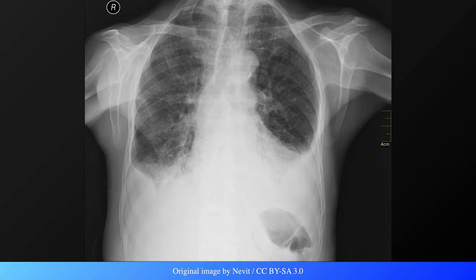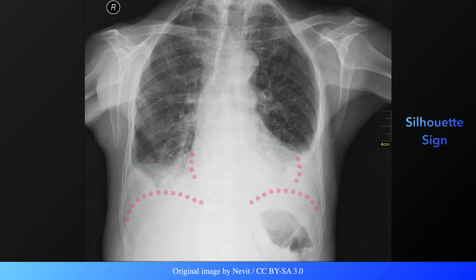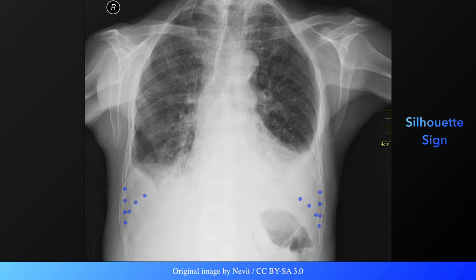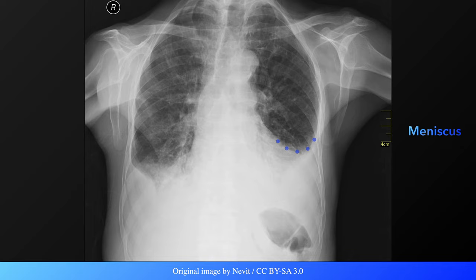This is a plain radiograph of an individual with bilateral pleural effusions. The first abnormality apparent is the dense homogeneous opacity present in the costophrenic angles. Unlike consolidation, air bronchograms are not present. Because of this dense opacity, the interface between the fluid and the heart border and hemidiaphragm is indistinct — this is known as the silhouette sign. The costophrenic angle is completely obliterated due to pleural fluid, which forms a meniscus with a concave upper border and an ascending lateral tip.